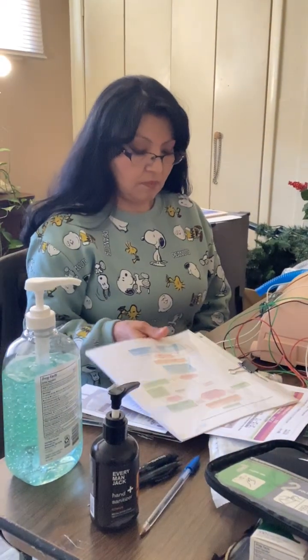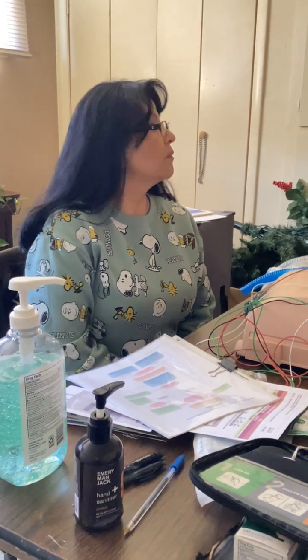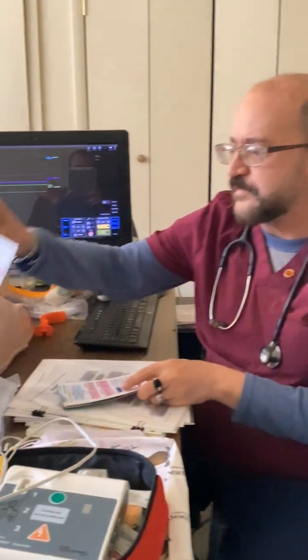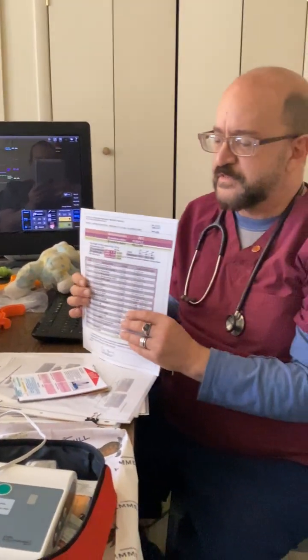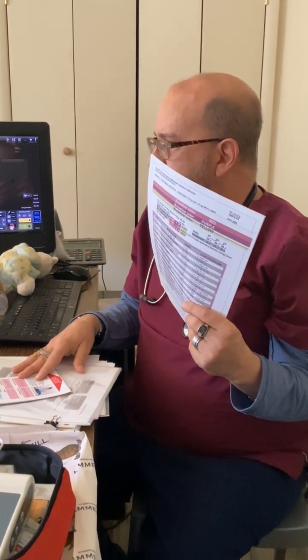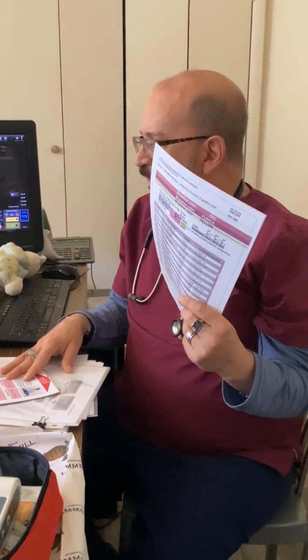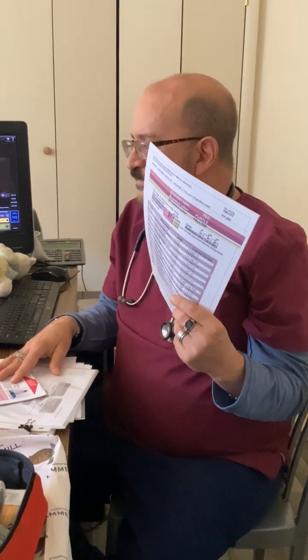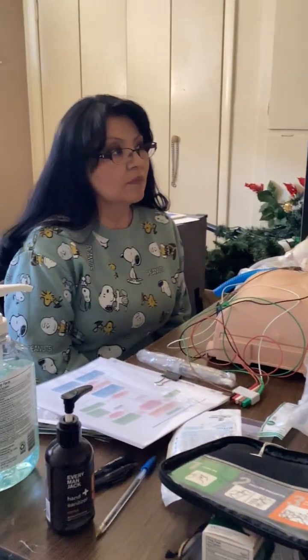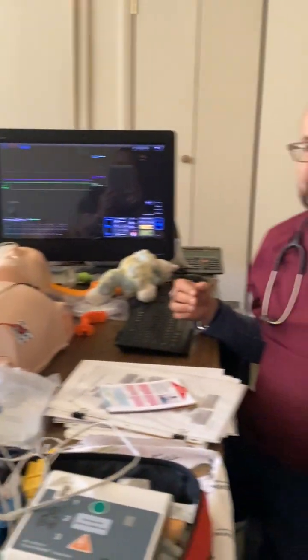because I don't want you to memorize medication doses. So as we're talking about medications, I have a cheat sheet for you by the Broselow system. Broselow is a system that measures by length. You use length when you don't know the weight. This tape will measure from 3 to 36 kilograms. So it helps you to decide on medications like resuscitative meds like epi, amiodarone, atropine, just a variety of meds, fluid boluses for those age groups.